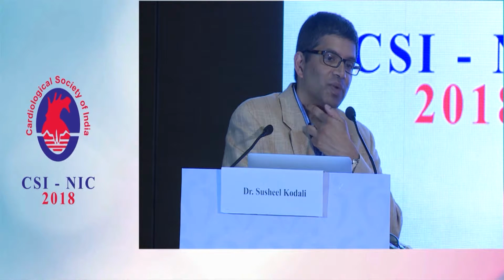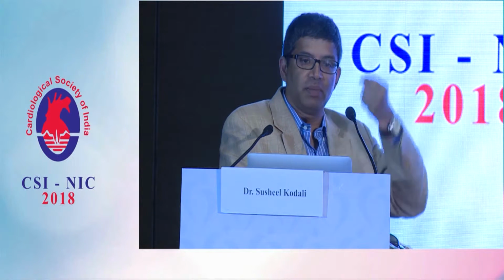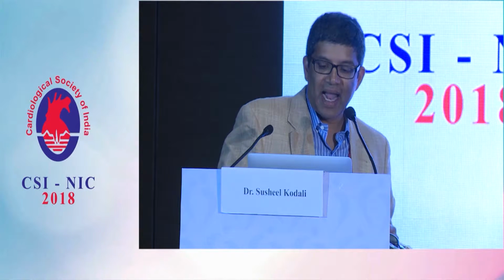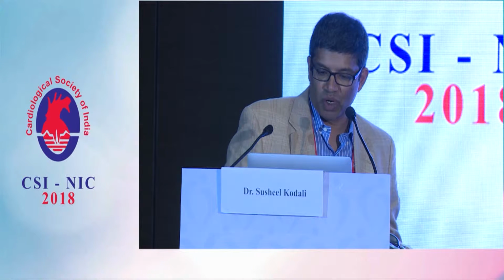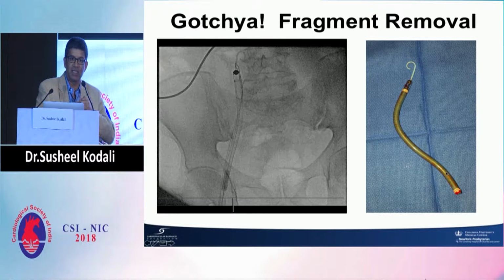Yeah, I think the easiest thing, in retrospect. Jugulars are bigger than femorals. And easiest also is you would pull up and the bullet of the device would come into the sheath much more easily. The back end of the device is what was not able to, when you put a snare on here, it was kinking the device.